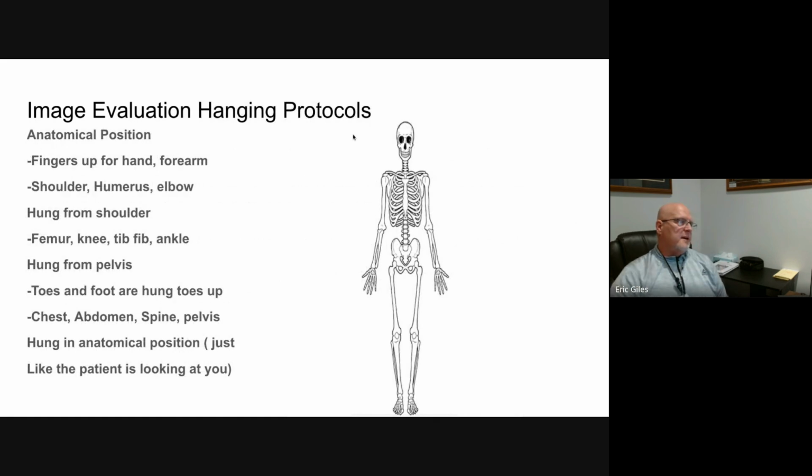Okay, so image evaluation and hanging protocols. Now, when you see hanging protocols, that is the protocol that is put in place to hang that image in front of you. What does that image need to look like on the computer screen when you save that image, right? Okay, so here's a few tips for you.